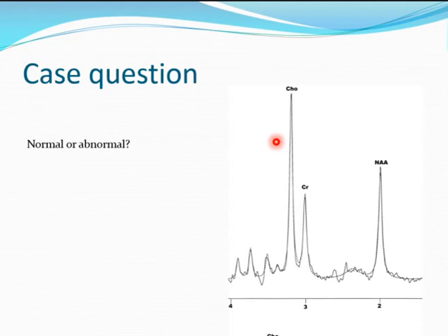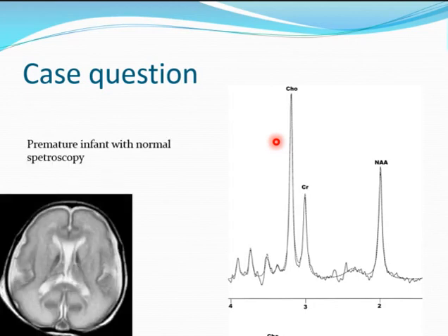High peak choline and low NAA. So, this should indicate what? First of all, you never ever interpret a spectrum without having a normal brain, the conventional brain image. Okay? This is the brain MRI. What do you see here?